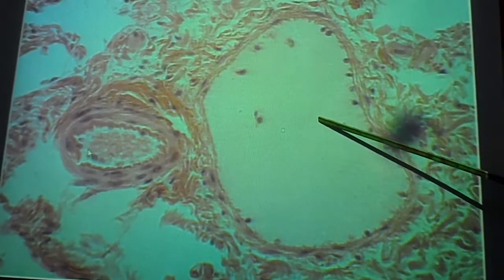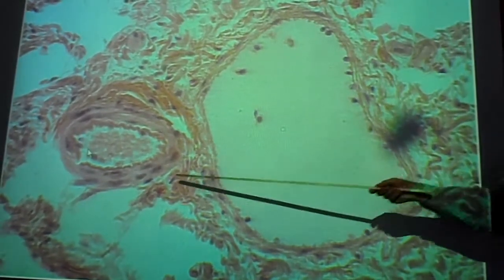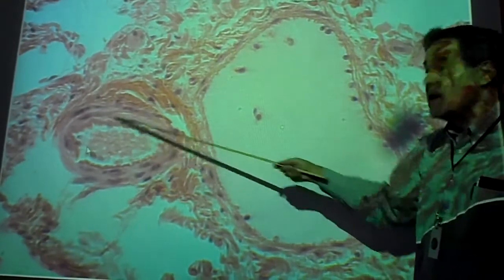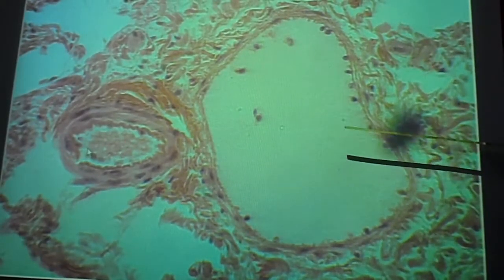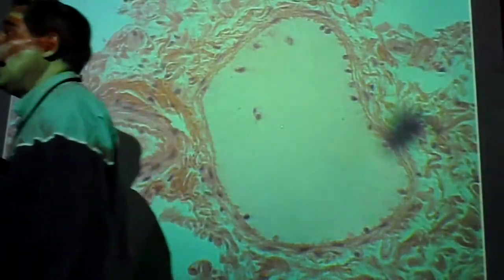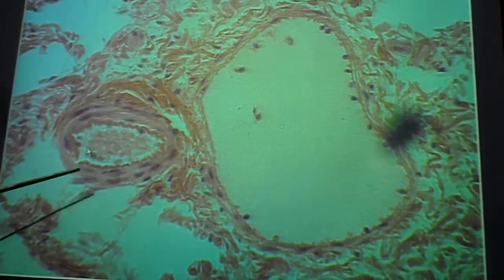This is a venule. You can see it's much thinner walled, with a much larger lumen than the corresponding arteriole, which has a smaller lumen and thicker wall. Again, it holds its shape. This venule is called a portal venule, or you can call it a hepatic portal. Do not call it hepatic portal vein. It's not the hepatic portal vein. It's a tiny branch coming from that.